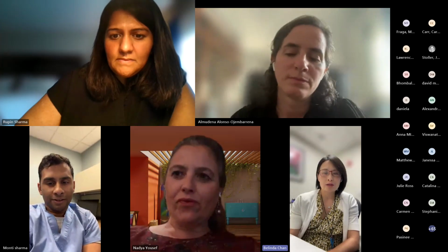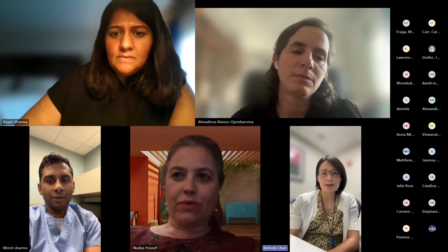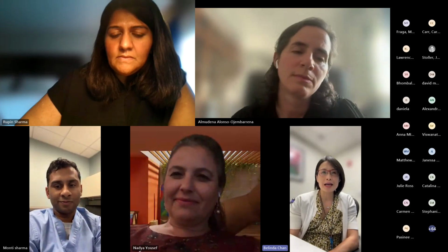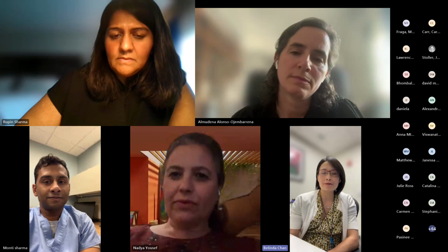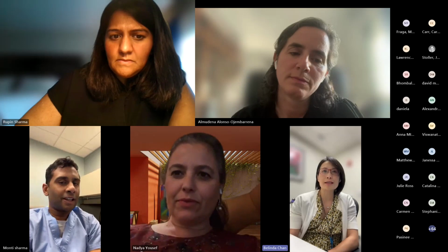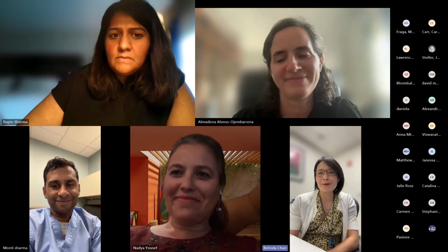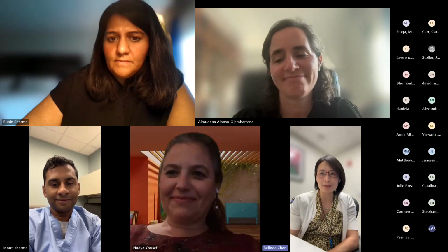How do you train enough people, all the neonatologists, to learn ultrasound and to use it as a clinical practice? That is more challenging. FiO2 people are familiar with, easy to do, anyone can do that, but lung ultrasound is much harder to do in a clinical setting. And then as Monty said, you have to standardize it at the beginning. That process takes a while. And then what kind of machine you use. Hopefully in the near future that becomes part of the standard of practice. Instead of listening with a stethoscope, you use lung ultrasound, which is as non-invasive as a stethoscope, but gives you more information, and hopefully we will get to that point.